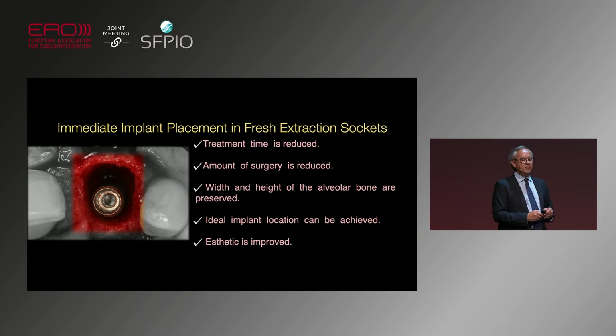And basically, through these 15 minutes, I will try to answer some of these questions, because we may say that immediate implant placement is the ideal surgical protocol because the treatment time is reduced, the amount of surgery is also reduced, width and height of the alveolar bone are preserved, I can attain ideal implant location, and the aesthetics are improved. And the question is, is all this true?